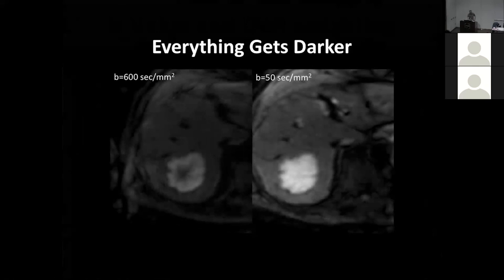And this lesion compared to background liver might look brighter here than here, but I promise you that the lesion is darker here on the high B value than it was. And just to illustrate that, I take the tumor and put it here. You can see that this tumor actually got darker. It just didn't get as dark as other structures in the background.